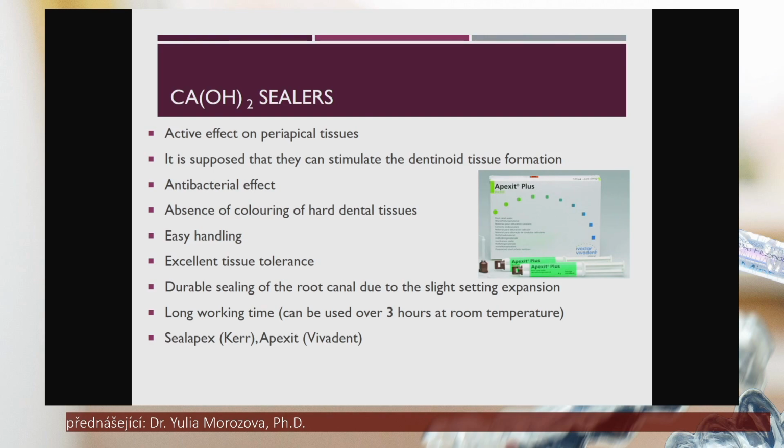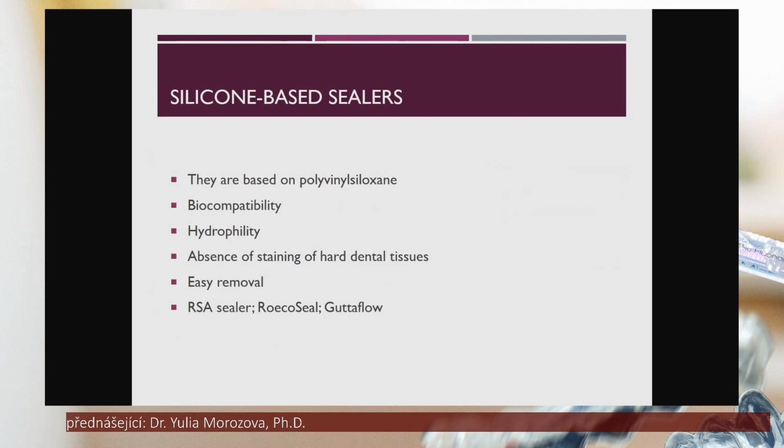Mostly they are placed in these special syringes, and when we put it, there is mixing in this application cannula, and we will receive the material that is ready to be used.